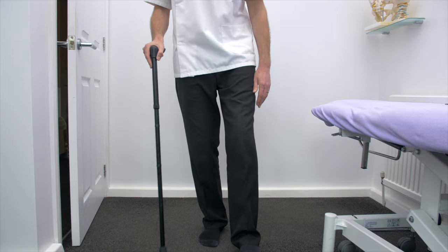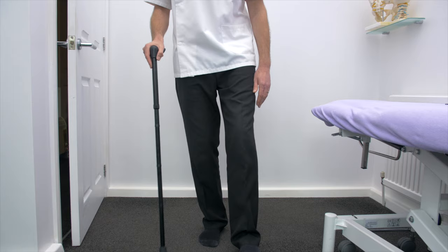As I walk forward, the bad leg comes forward and the weight is taken onto your arm and onto the stick. As you transfer through, the weight goes onto your good leg.